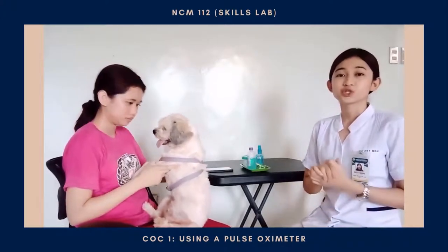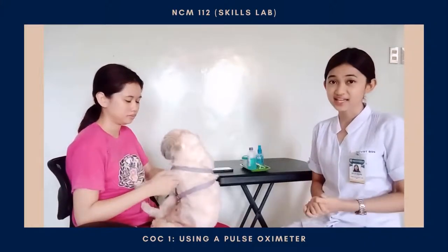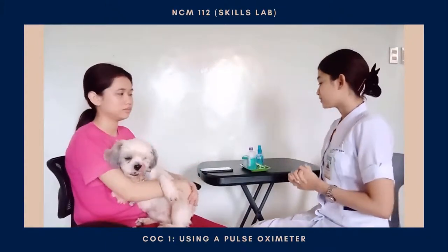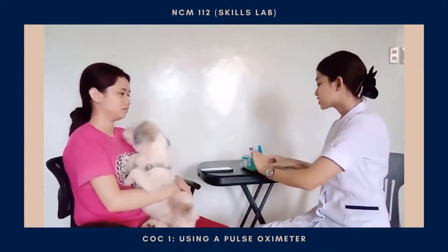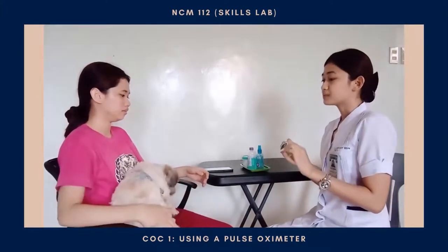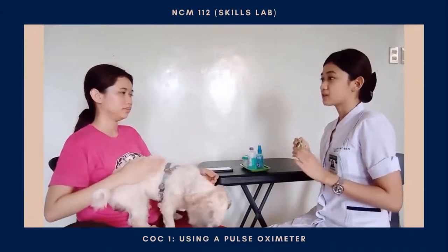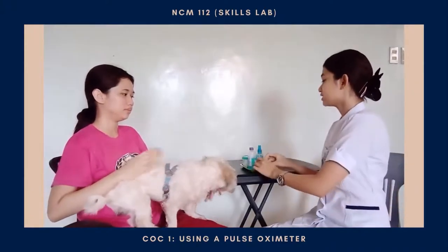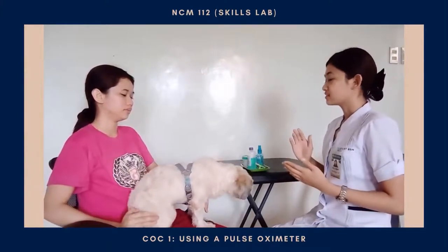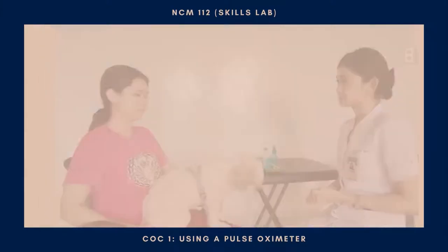Explain to the client what you're going to do and why it is necessary to lessen their anxiety and promote their cooperation. So now I will be doing a procedure which requires me to use this device called the pulse oximeter. I will be placing this device in between your index finger to measure the level of oxygen in your body. This will help us to see if your condition is improving. And now this procedure is painless and will only take about a minute.